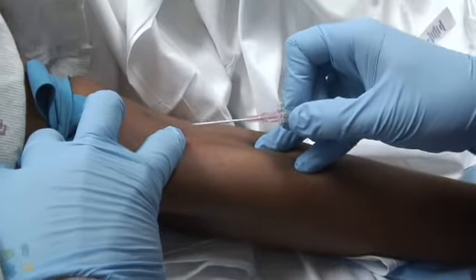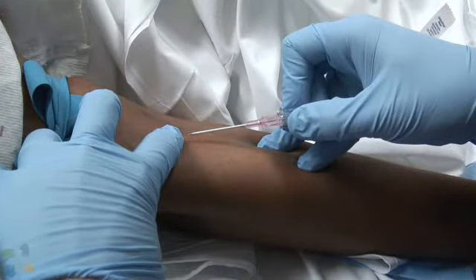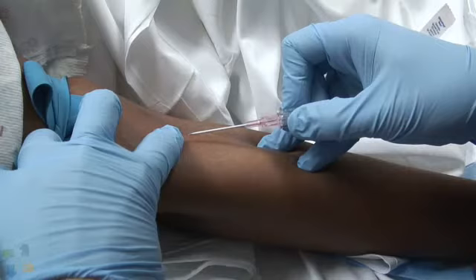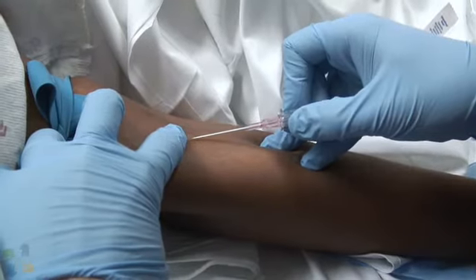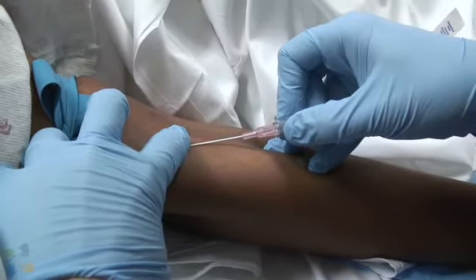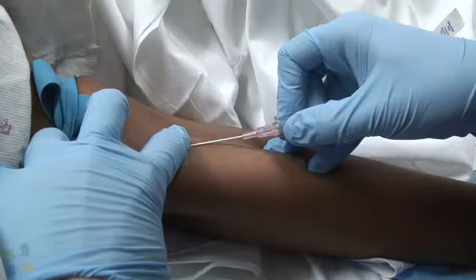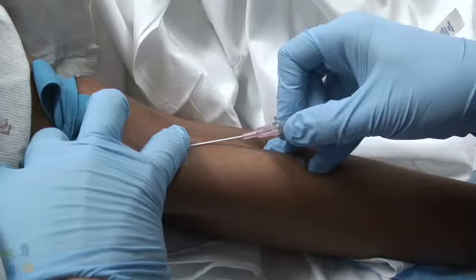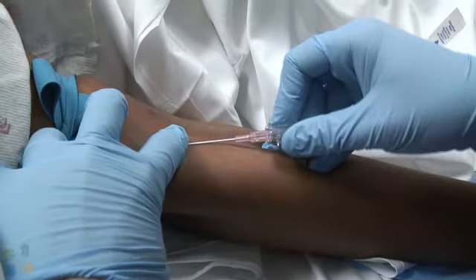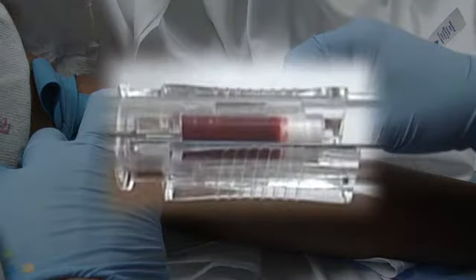Take the catheter with your dominant hand between your thumb and forefinger. Make sure the bevel is pointed up. Insert the catheter parallel to the course of the vein at an angle of 10 to 30 degrees to the patient's skin. Puncture the vein with firm pressure and watch for the flash of blood within the catheter.